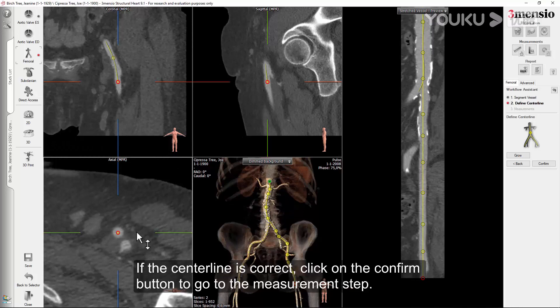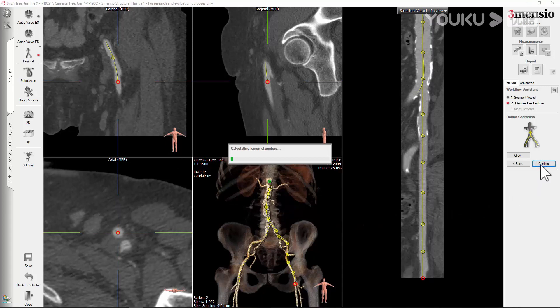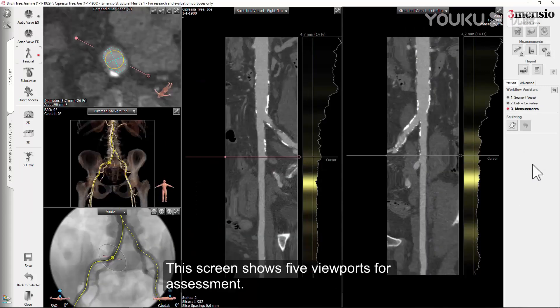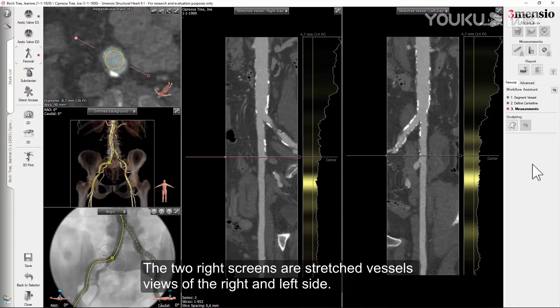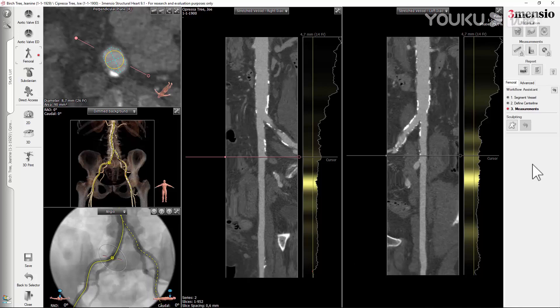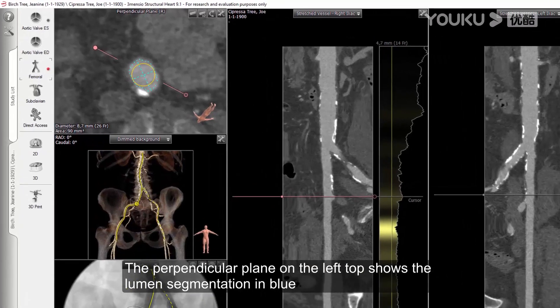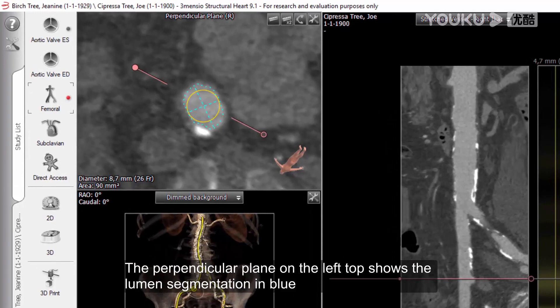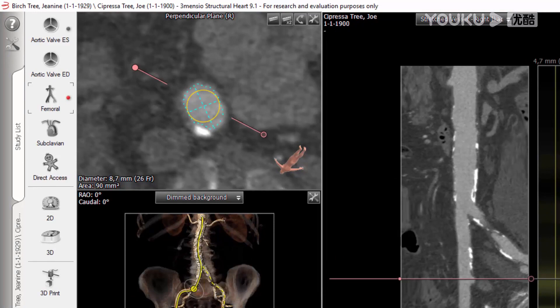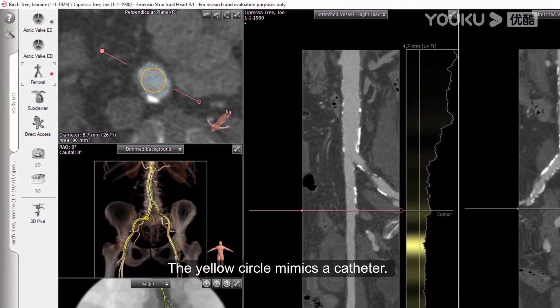If the centerline is correct, click on the Confirm button to go to the measurements tab. This screen shows five viewports for assessment. The two right screens are stretched vessel views of the right and left side. The graph next to the stretch vessel view gives an overview of the diameters and tortuosity. The perpendicular plane on the top left shows the lumen segmentation in blue and the largest possible circle within that segmentation in yellow.